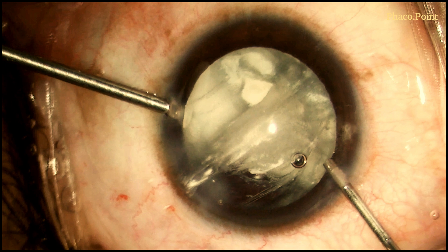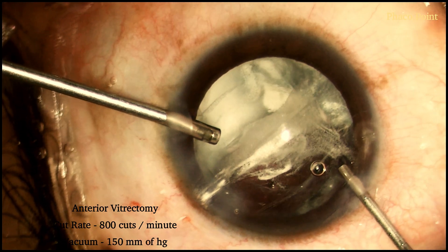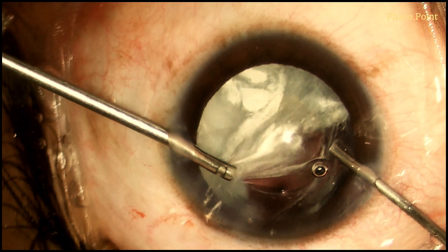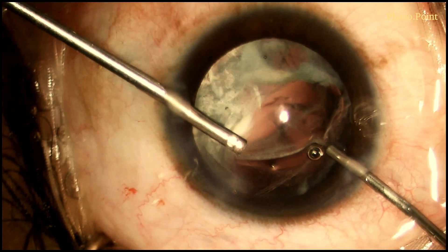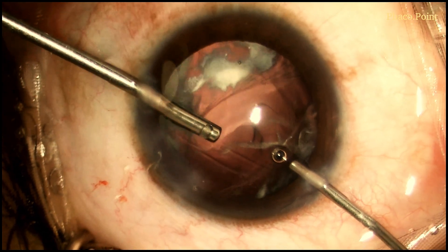Having introduced the cutter, the vitreous is now cut from just within the wound, typically at that point where the vitreous tends to prolapse out of the incision. You will notice then how we proceed to cut the vitreous in the area of the pupillary plane. And having completed that, we then move to the area just above the PCR.